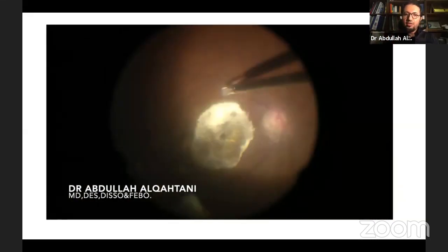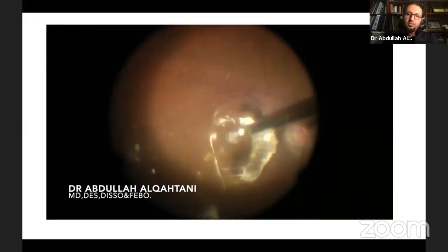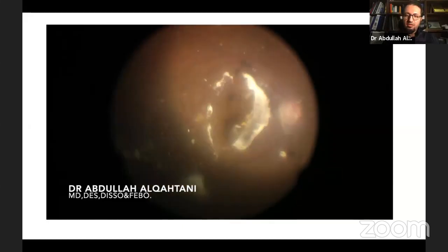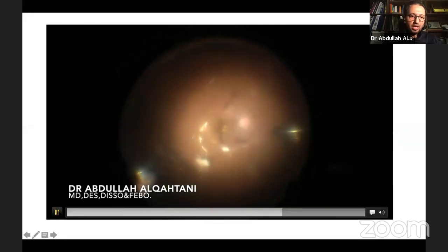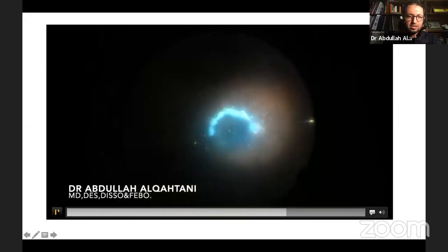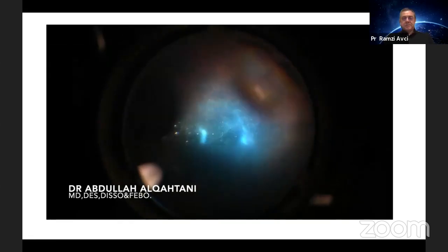Then with that silicone tip, with the forceps that you grasp it with, you can just scratch the cortex remnant and take it away. Then you can complete it with the vitrectomy. Actually, sometimes I use it even to open the flap of the ILM if I need some dissection whenever I don't have any silicone tip or Finesse loop.